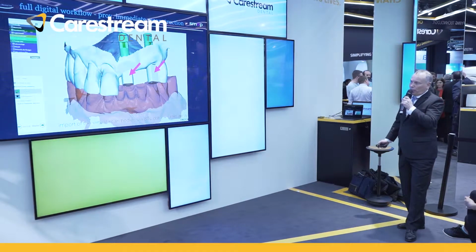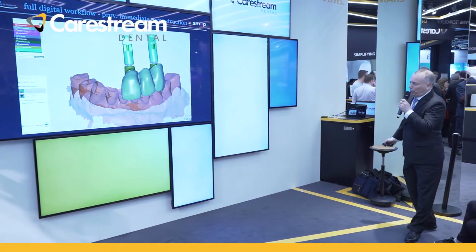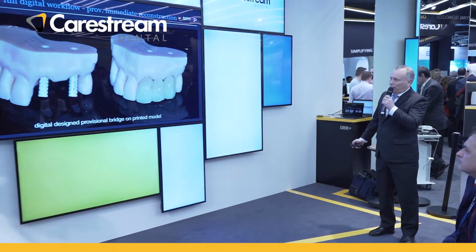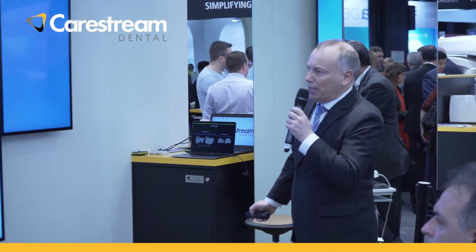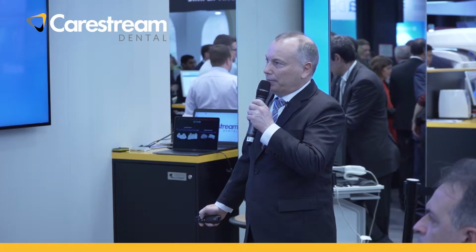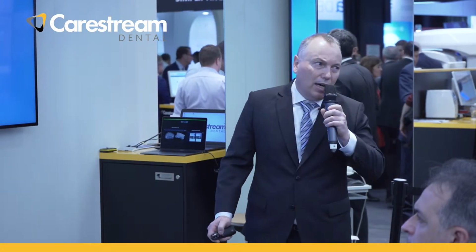Here we have the situation now in ExoCAD. And my dental technician was fabricating a provisional acrylic bridge. Here on the models, to test if it was fitting, we had abutments, these titanium cylinders, and here is the provisional for this case. So you see all the steps are done digitally till now.